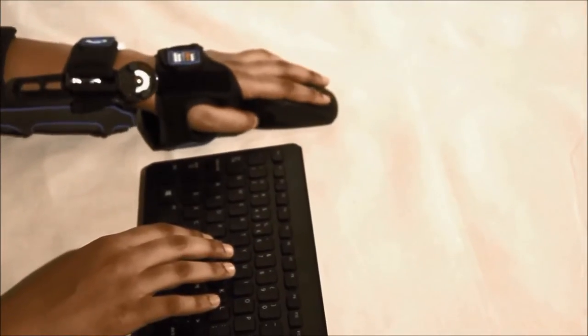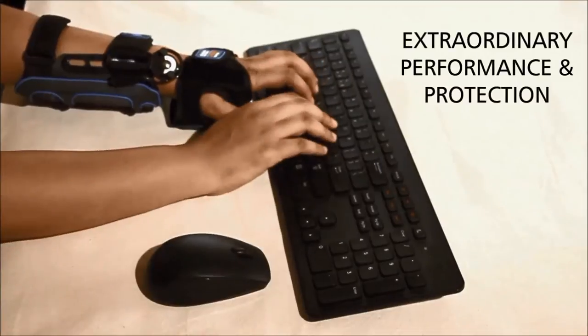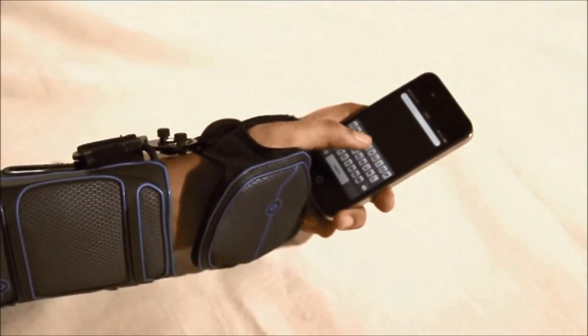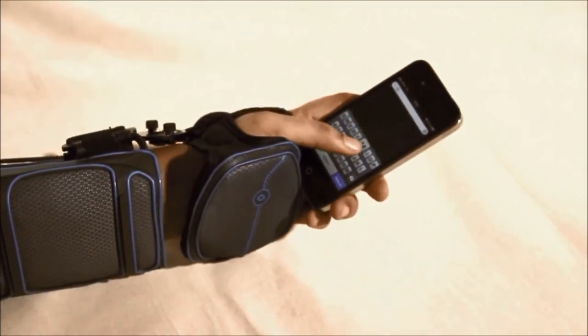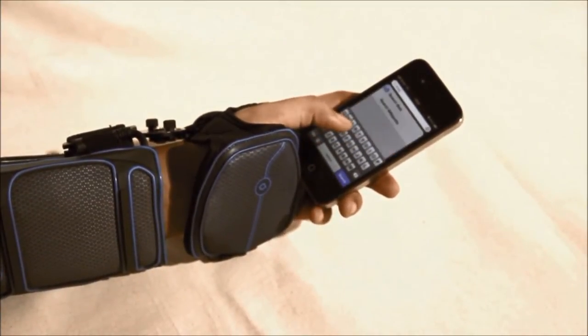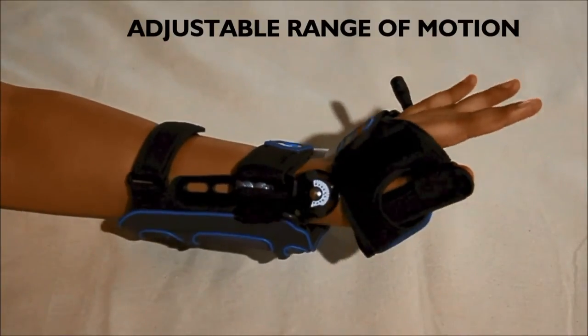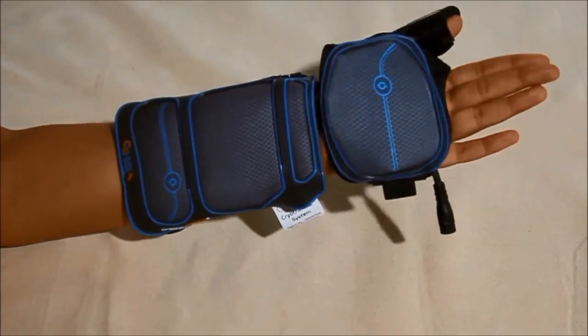This futuristic wrap is designed to provide extraordinary performance and protection for easy progression through various stages of post-injury recovery, rehabilitation, and return to action. The articulating hinge system offers adjustable range of motion from full extension and flexion in increments of 10 degrees.